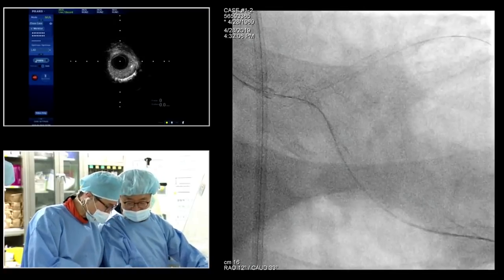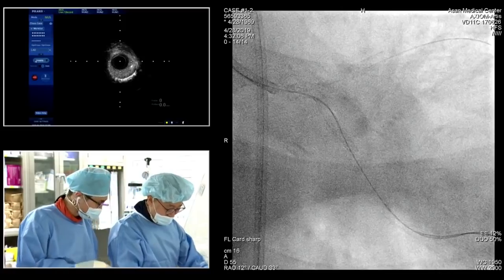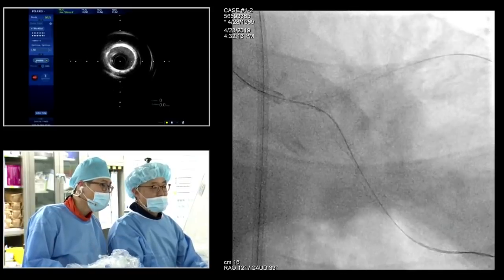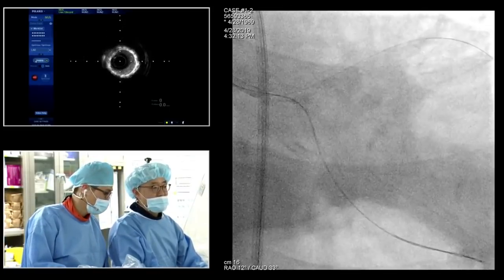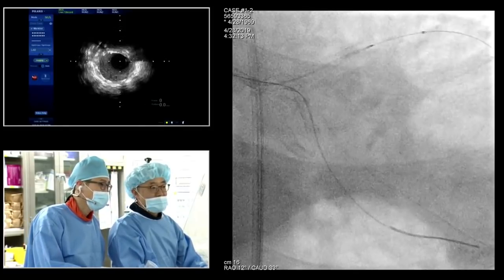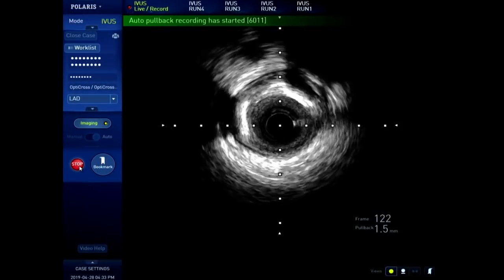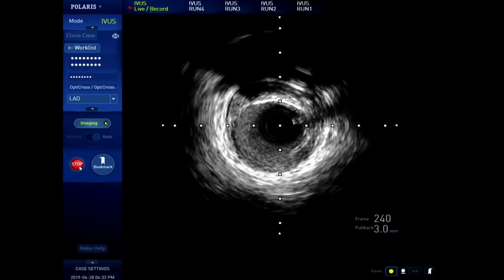If the cell of the stent is oriented more distally, it's better to cross more distally. To be absolutely sure about the optimal crossing part, you should do OCT to establish the optimal position, but I think it's too complicated and not practical.